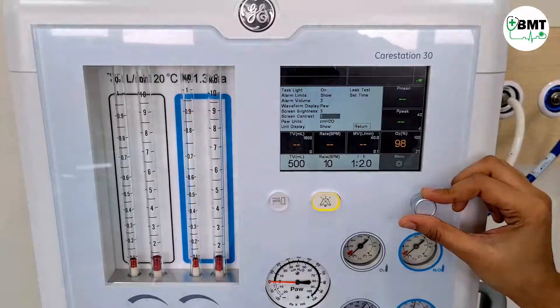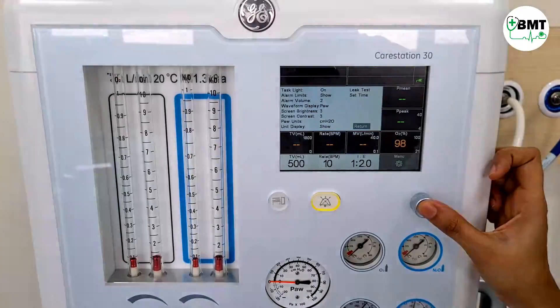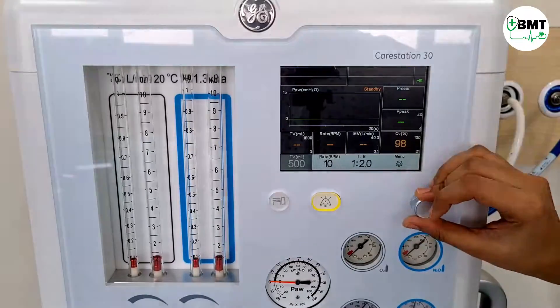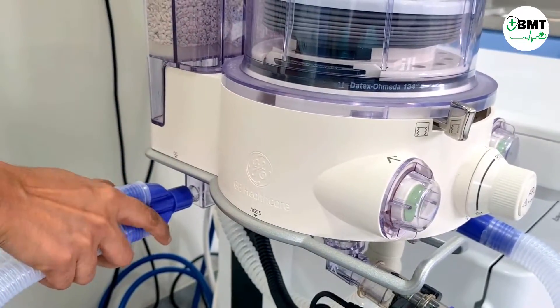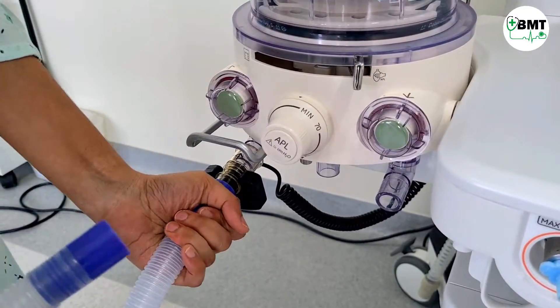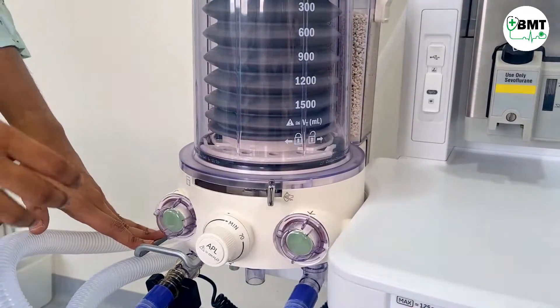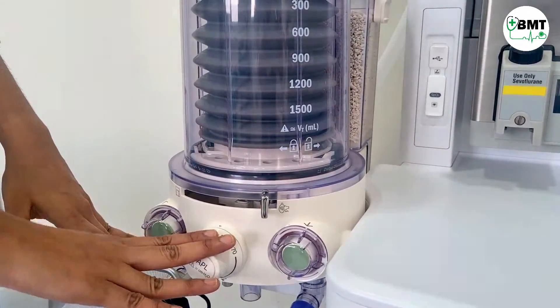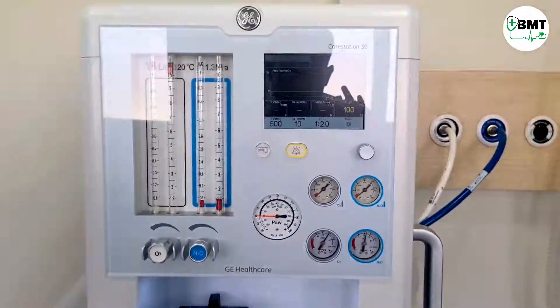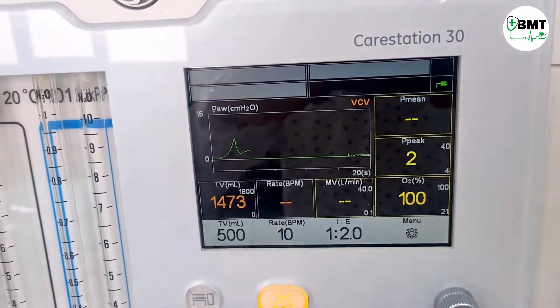Basic settings such as screen brightness and contrast can be done in setup. If you want to go back, press return, then OK. Once you have set the parameters, remove the white piece from occlusion and connect the patient. There is no specific start ventilation button on this anesthesia machine — to start ventilation, just move the switch to vent mode and ventilation will start automatically.